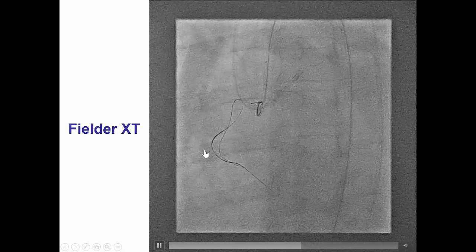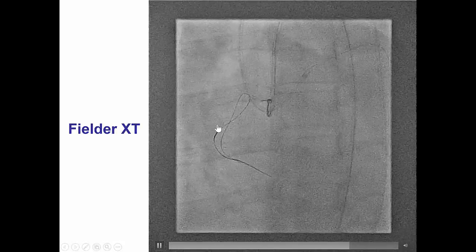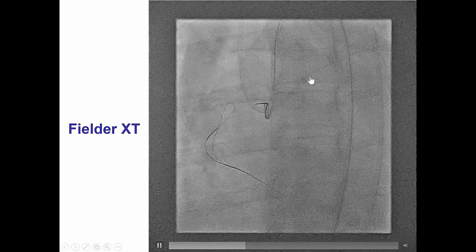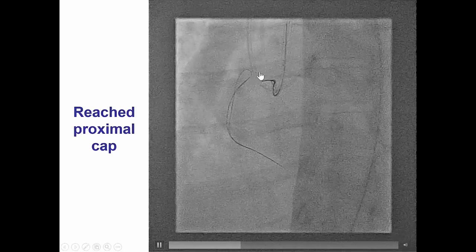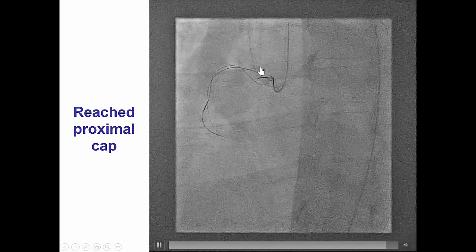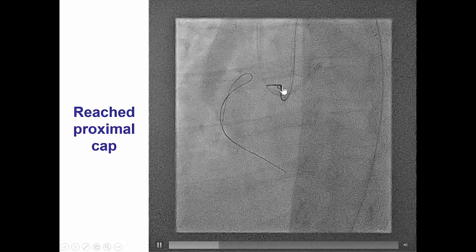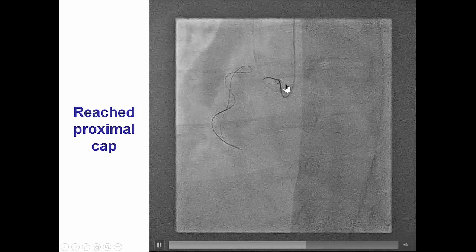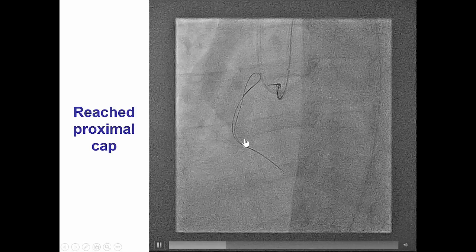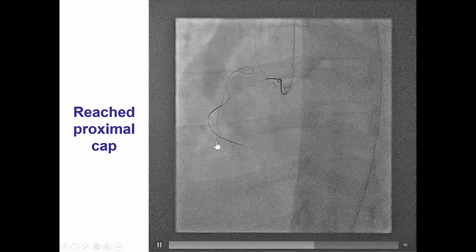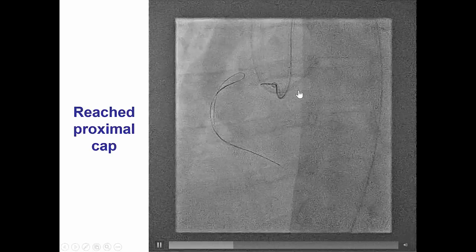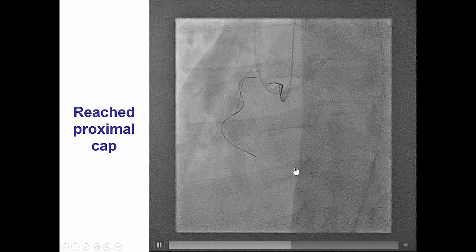After several attempts we were able to advance a Fielder XT wire past the mid RCA all the way to the proximal RCA, and then eventually advance the loop all the way to the proximal cap. This effectively resolved the ambiguity and helped us understand why we had difficulty antegrade — there is significant tortuosity, with the initial course of the right coronary going up then down with multiple bends. By using the retrograde knuckle, we clarified the vessel course from the ostium all the way to the distal cap.